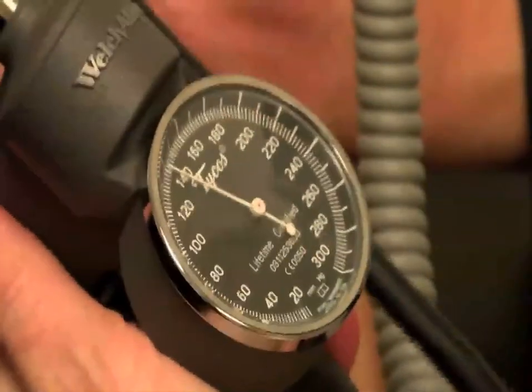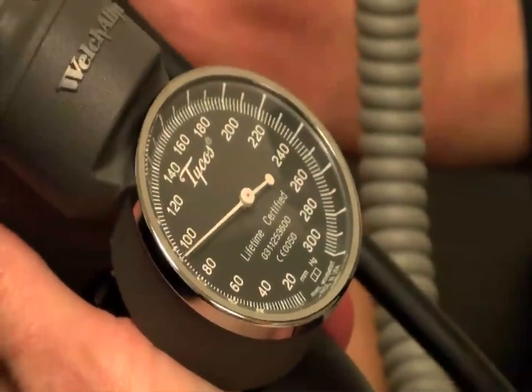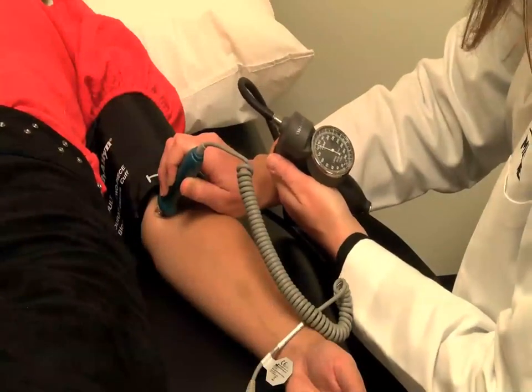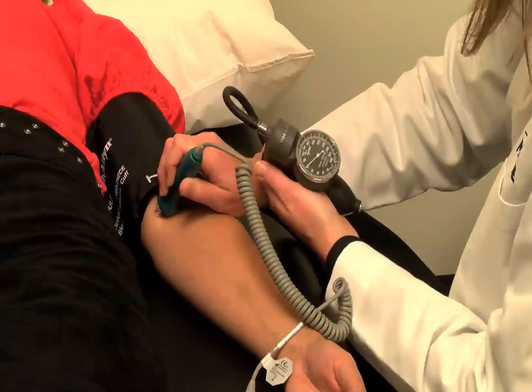Proceed by inflating the cuff until the Doppler signal disappears. Usually, 20 millimeters of mercury above their normal blood pressure is sufficient. Then gradually release the pressure valve until the signal returns. Record both systolic readings for the right and left arm. The higher of the two readings will be the denominator for our ABI calculations.